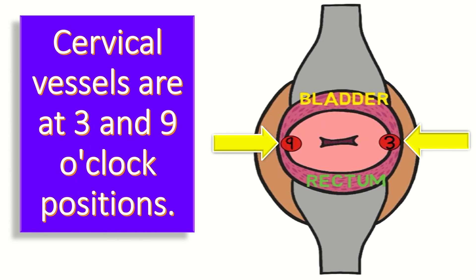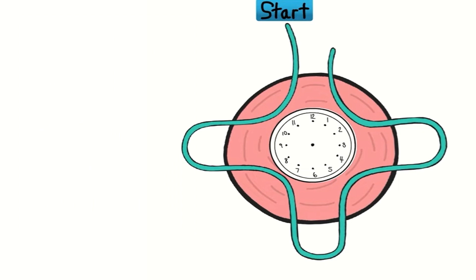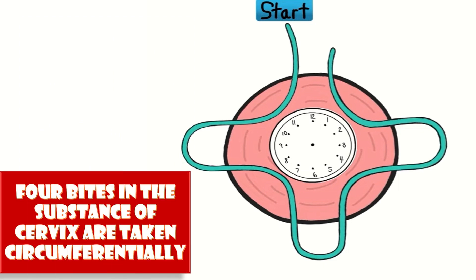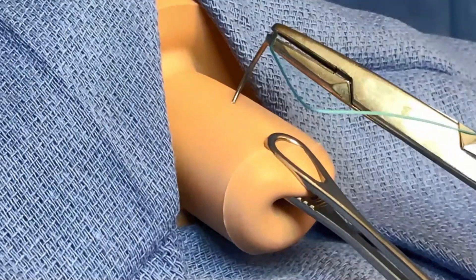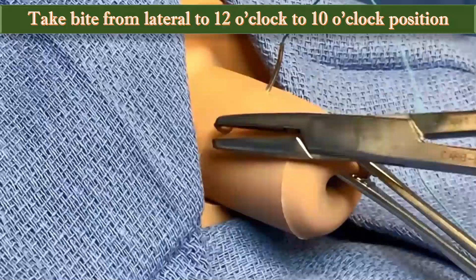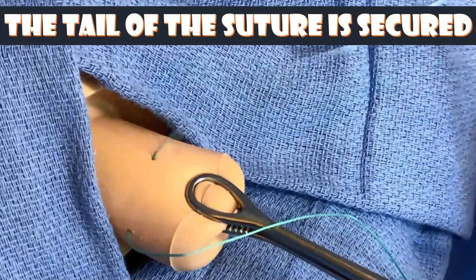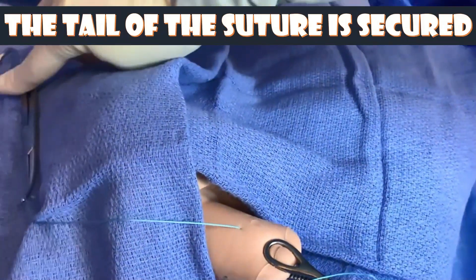Insert the needle at 11 o'clock and take it out at 10 o'clock. In this way, four bites in the substance of the cervix are taken circumferentially. The needle is inserted just lateral to the 12 o'clock position, as high as possible on the cervix, and passed through the 10 o'clock position. The tail of the suture is secured with a hemostat to prevent accidental pulling out.